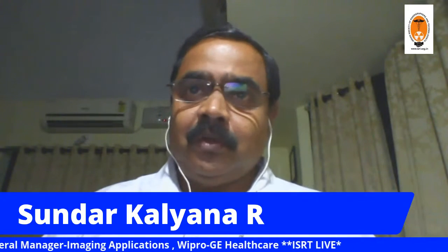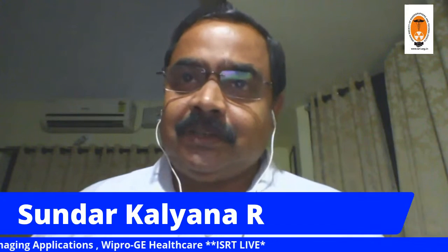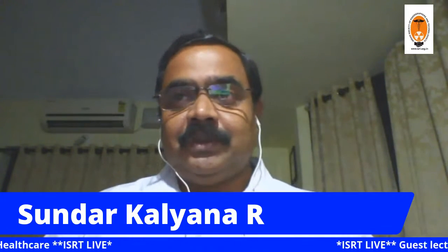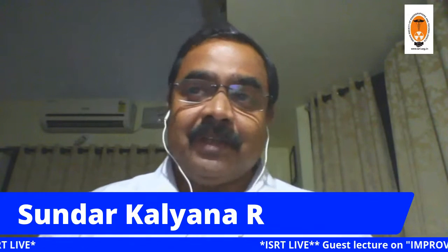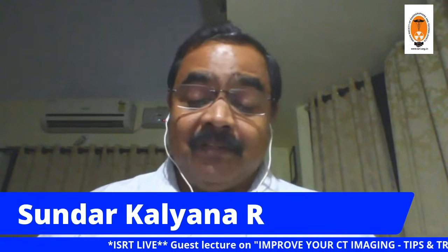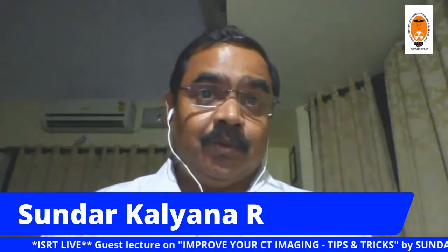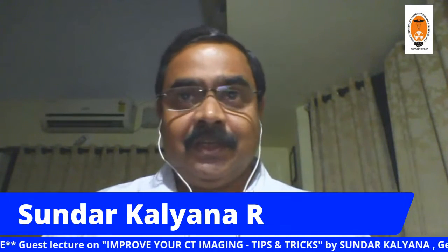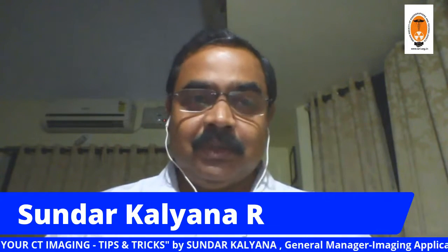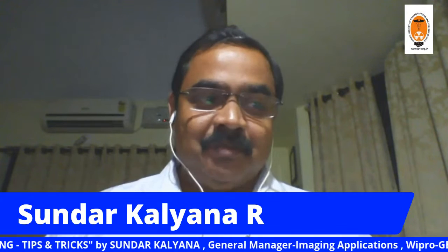But you may lose your low contrast detectability or contrast latitude. You may lose your soft tissue difference in conventional radiography when you use a high kV. That means, in a nutshell, use of high kV in conventional radiography will give a low dose. But when I presented on a slide, I said use of higher kV will increase the dose. Right? That's what is getting you confused. Am I right, Mahesh?